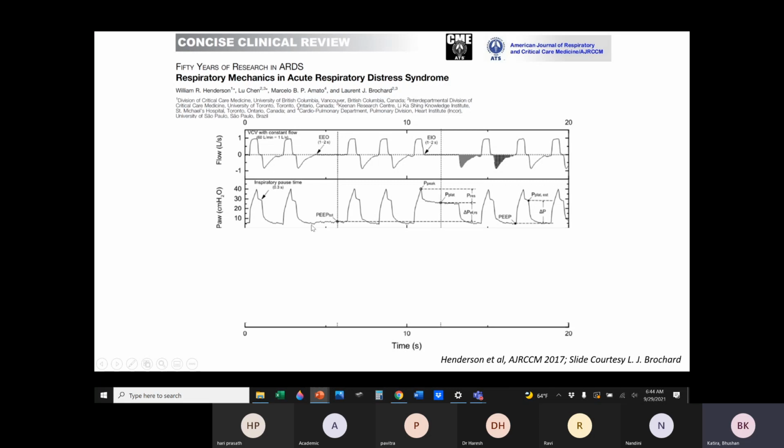This is an end expiratory occlusion in the PEEP, total PEEP, but there is an inspiratory pause of 0.3 seconds. You can see here when the flow goes zero. When the flow is zero, it is that time that the pressure measured on the airway is equal to alveolar pressure, and that is what is important. This becomes the plateau pressure.